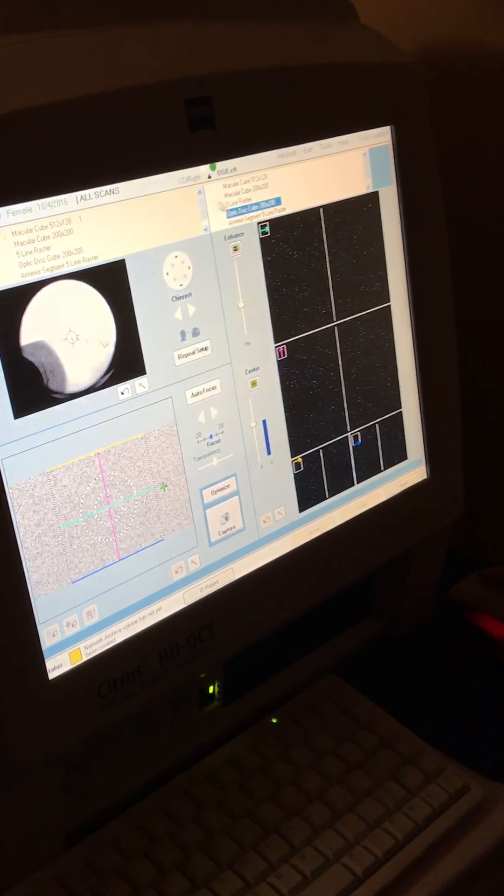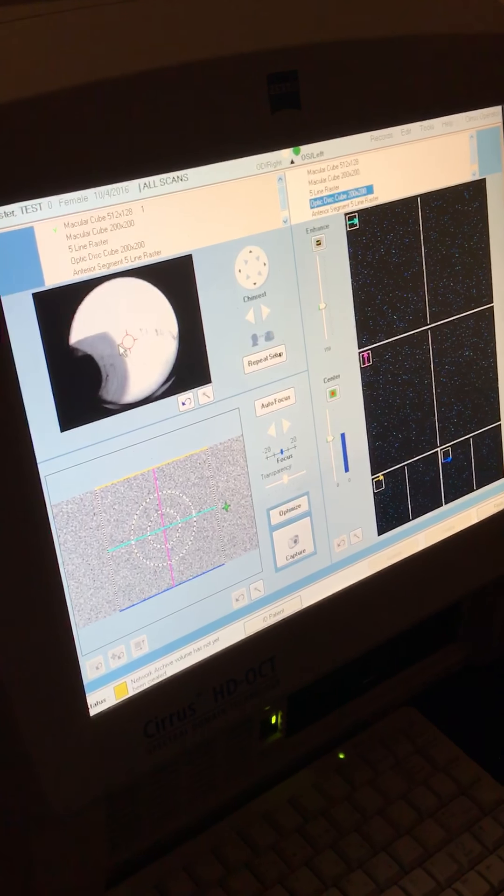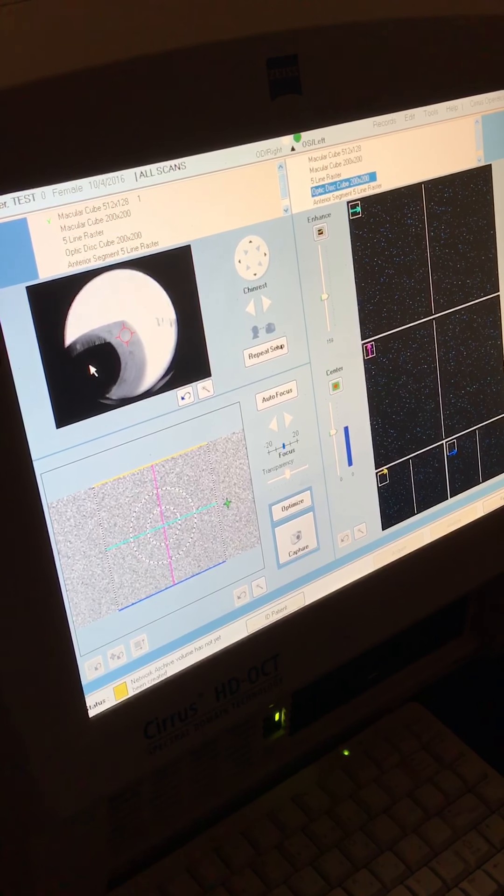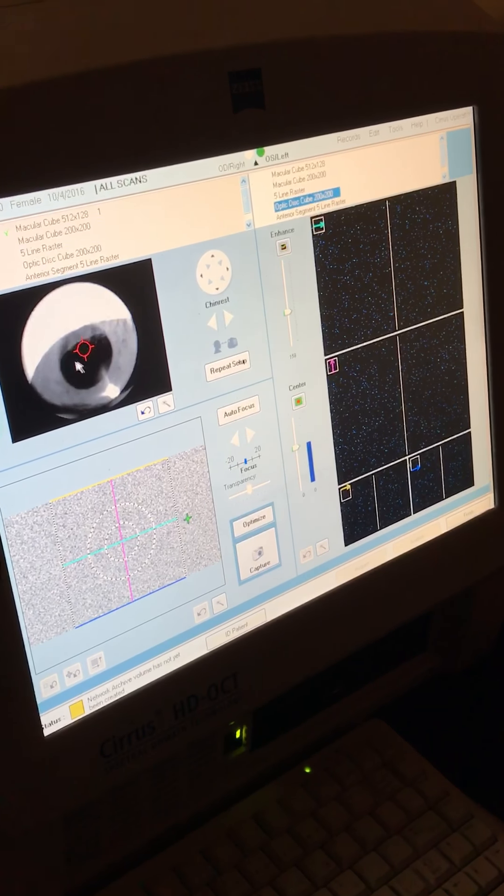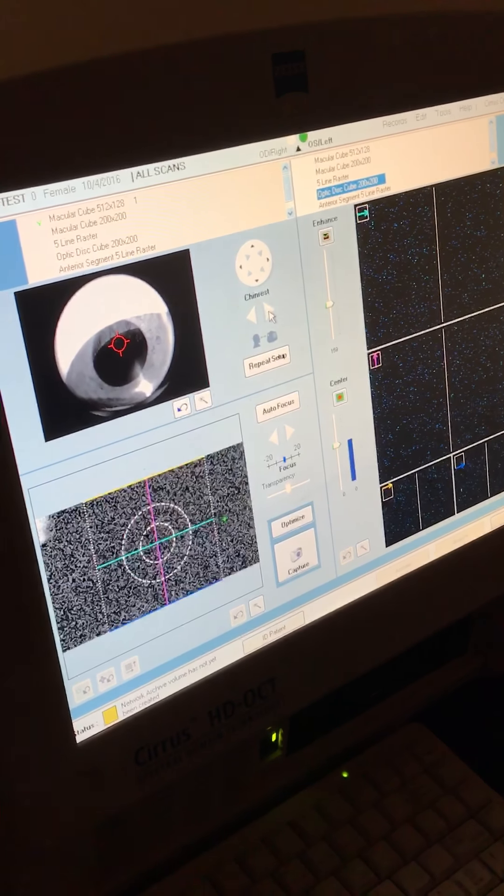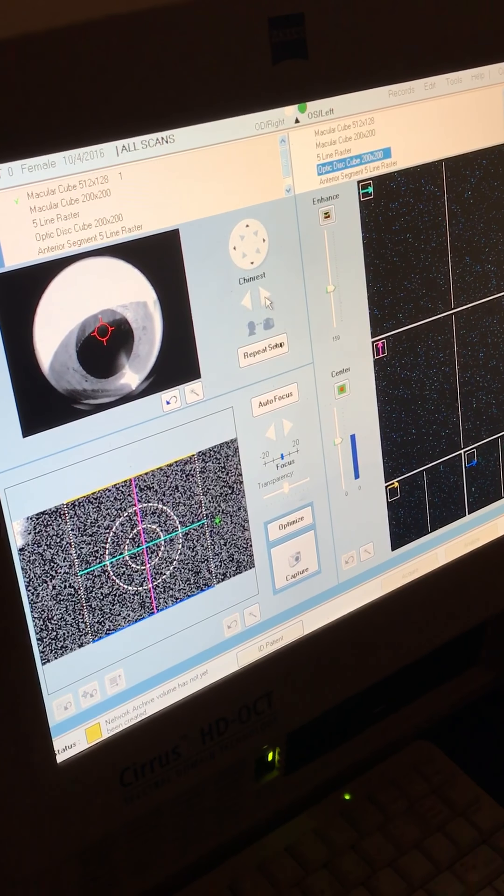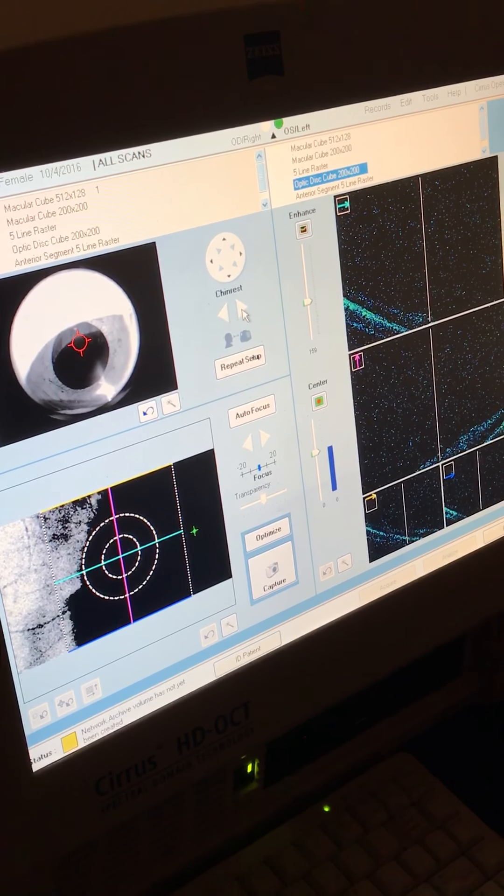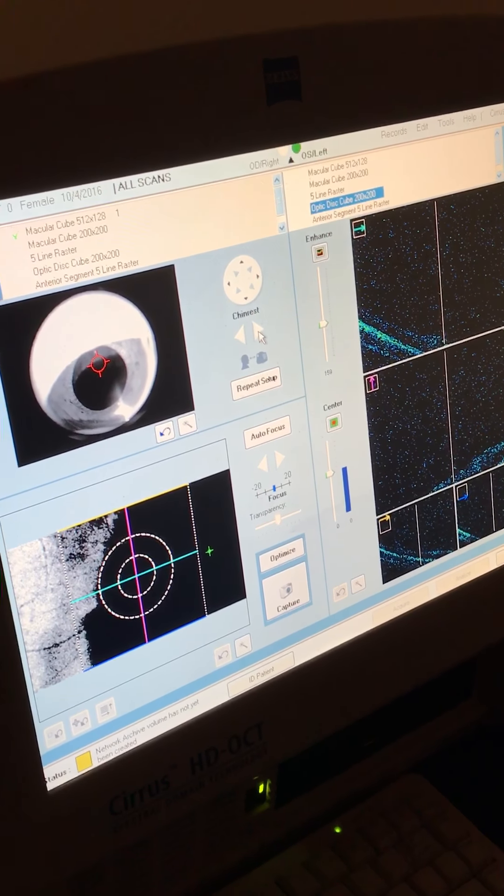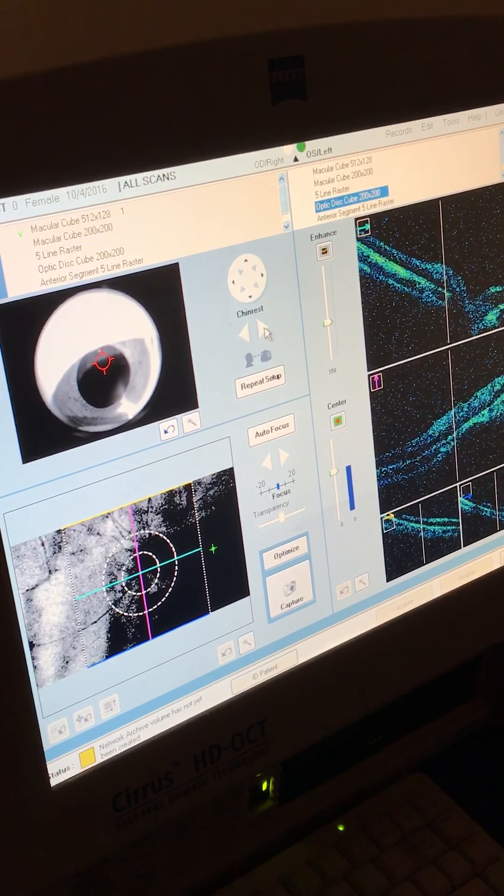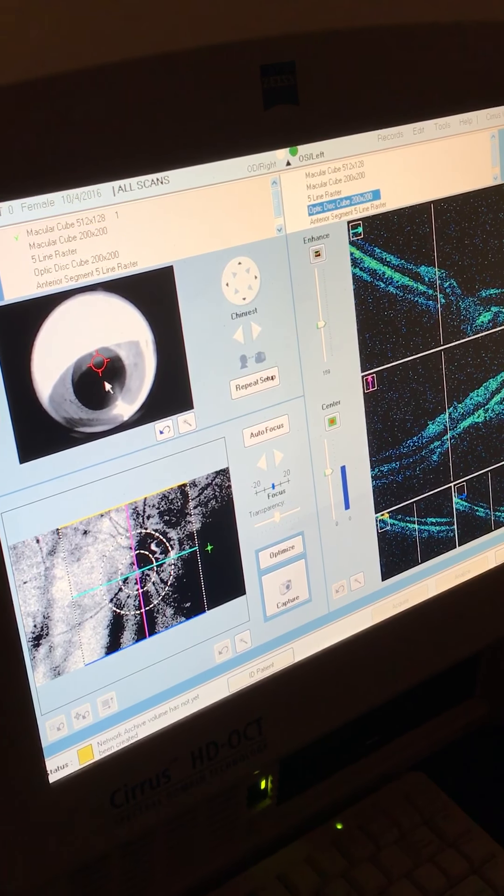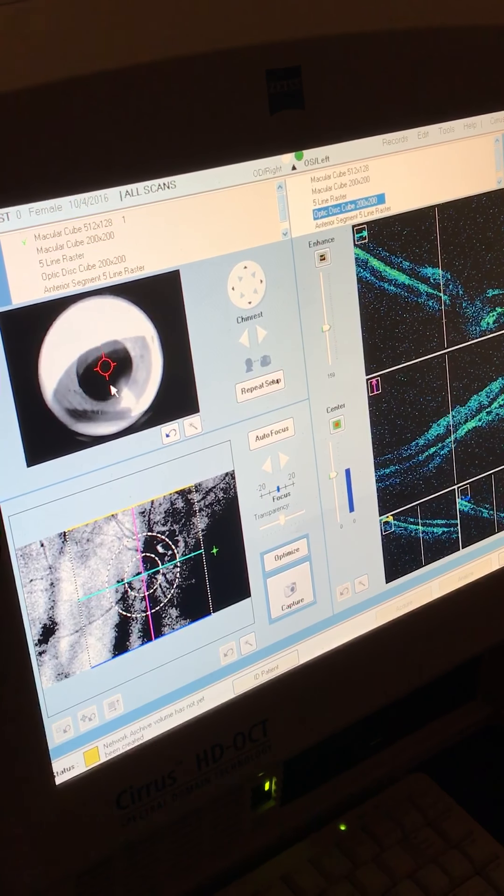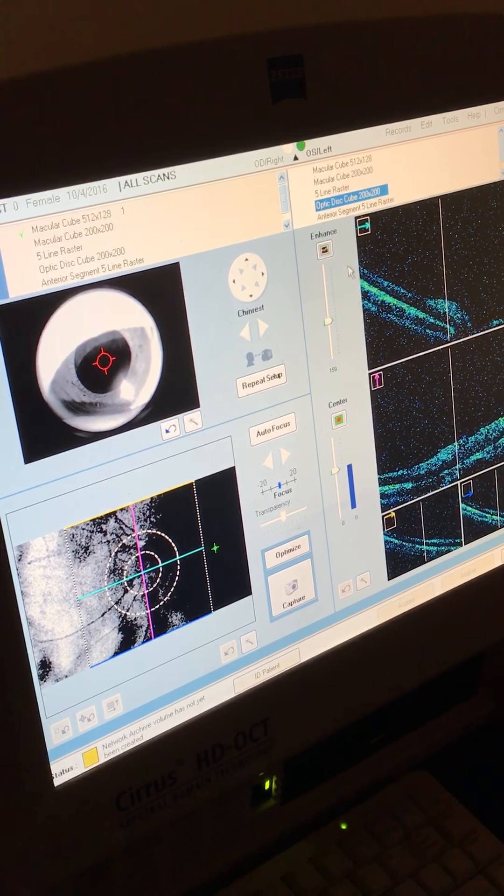So the machine will move now to her left eye. We're going to find her pupil again and we'll bring her close to the machine. And she'll be looking at a green star. For the OCTR, it'll be straight into the machine. For the OCTG, the disc cube, it'll be off to the side.